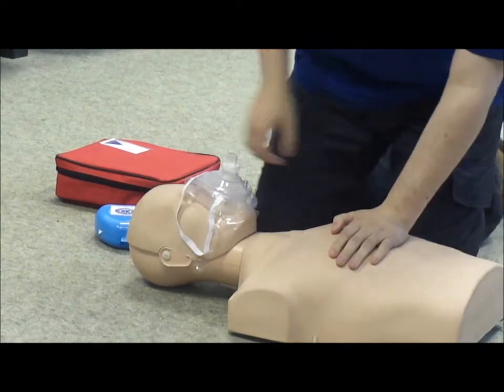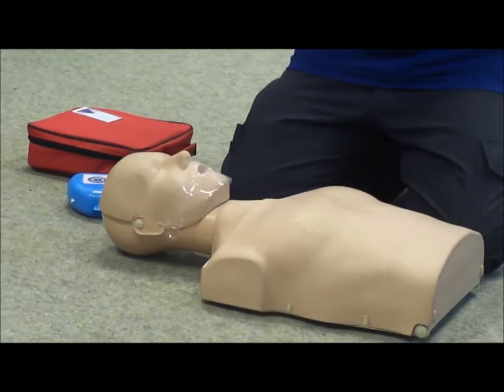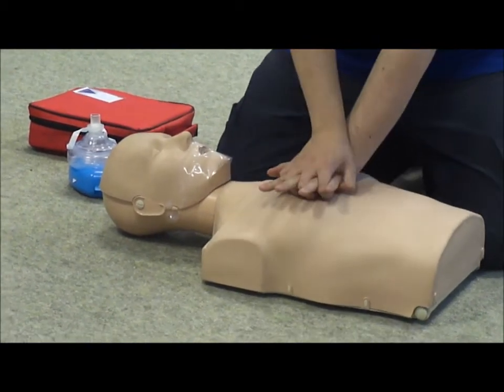I got chest rise there on the second one. The likelihood was I didn't get chest rise on the first because of a poor seal, and that's normally the main reason why we don't get chest rise. But it's only ever 2 breaths, and I'm straight back into my chest compressions.